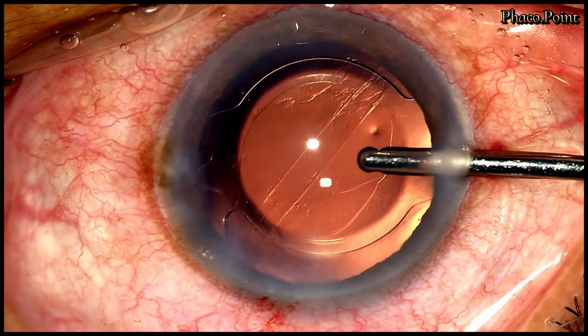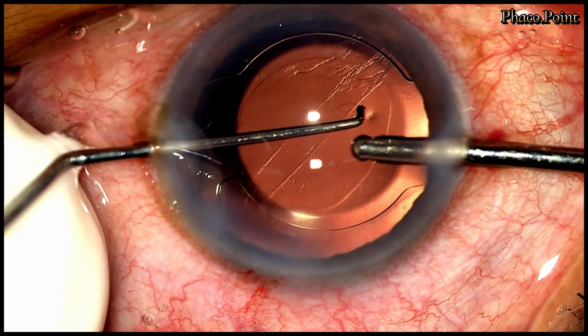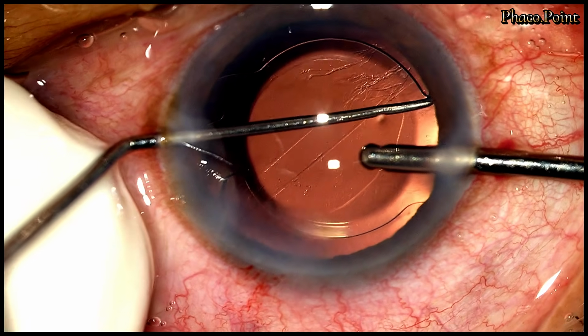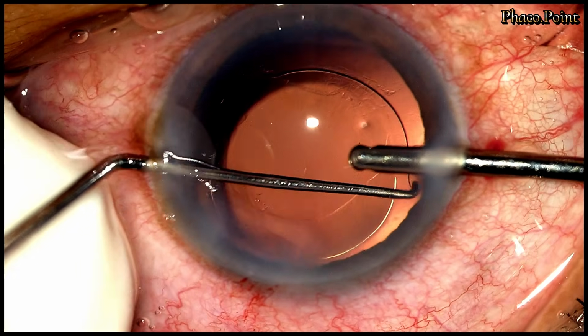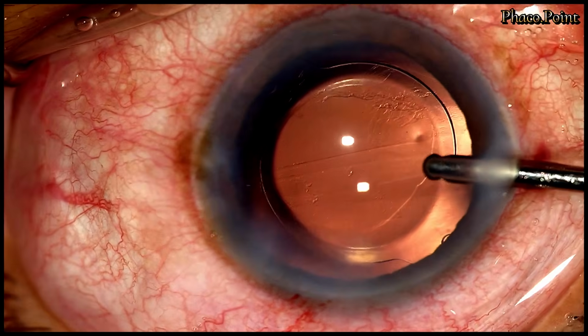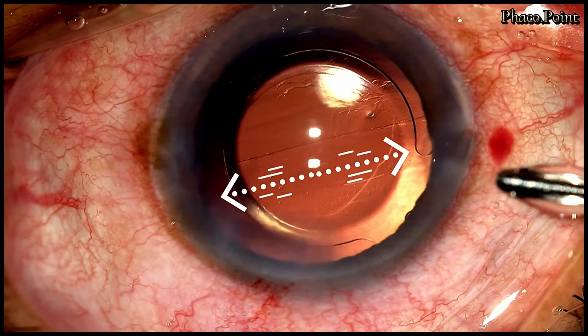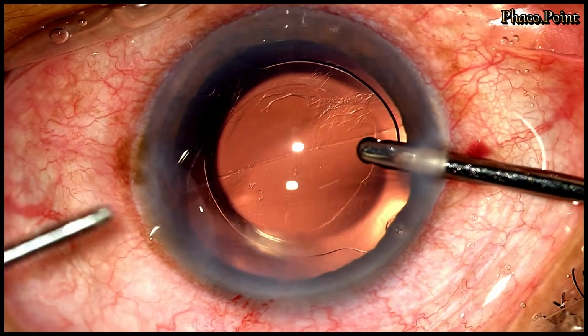And now let's see what happens when we attempt to rotate the IOL. With the help of a Sinskey hook, whilst still maintaining the irrigation in the eye, the optic-haptic junction is held and the IOL rotated. You will now notice with the new position of the IOL haptics, the folds in the posterior capsule also change in their orientation. We now move to completing the visco wash.